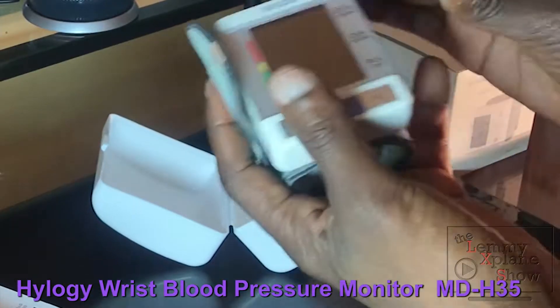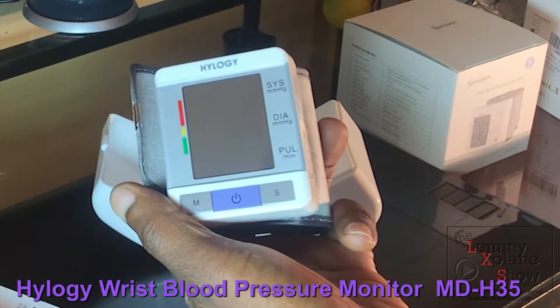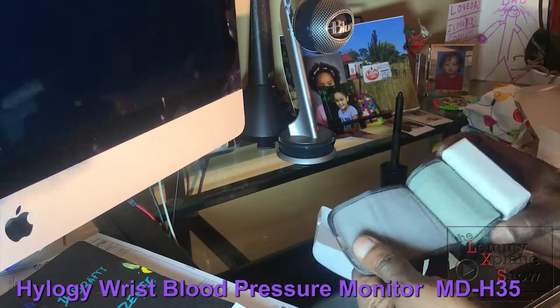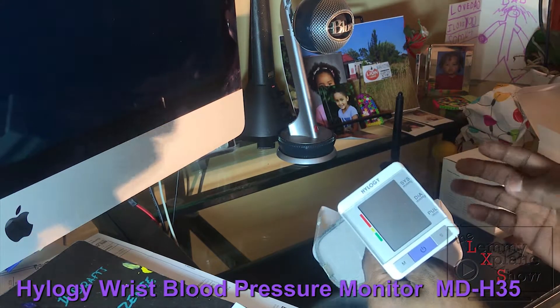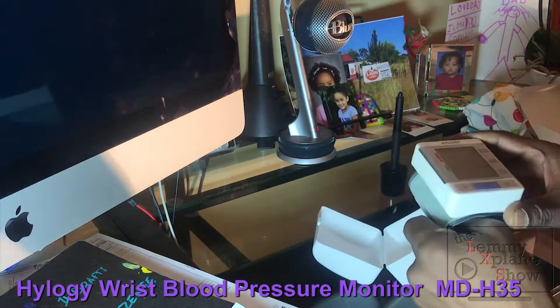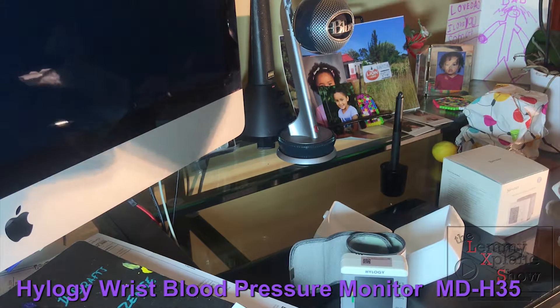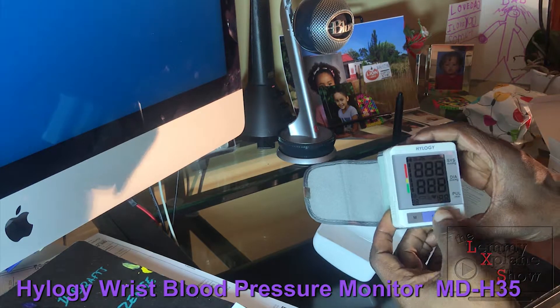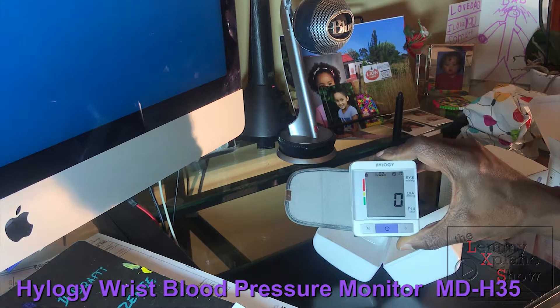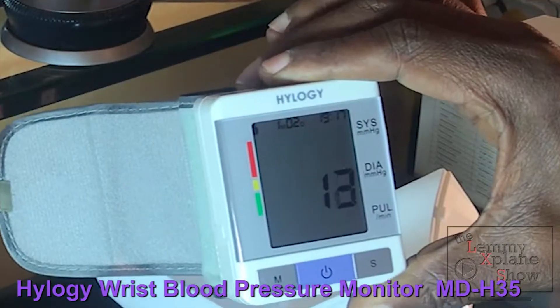Off the bat, it's a lightweight device — it doesn't weigh too much, so that's a plus. It seems to be pretty much the same construction in terms of the strap and the build as the previous model. The predecessor came with batteries, but this one — actually, the batteries are already installed, so that's fantastic and it's ready to go.